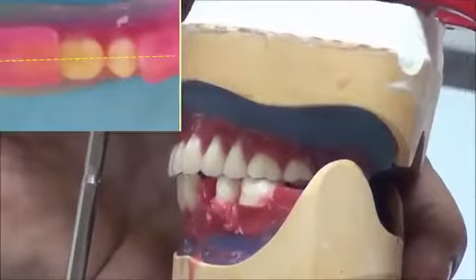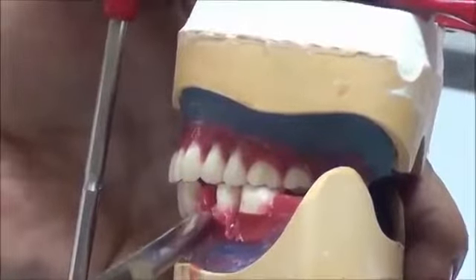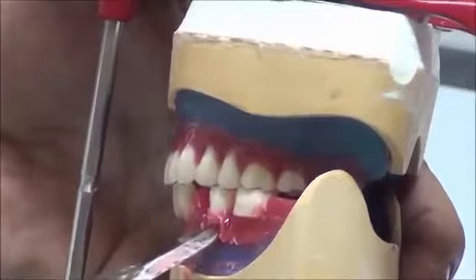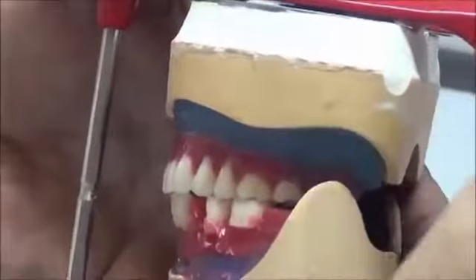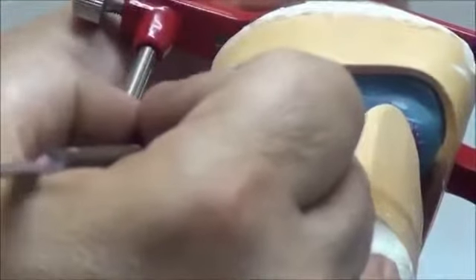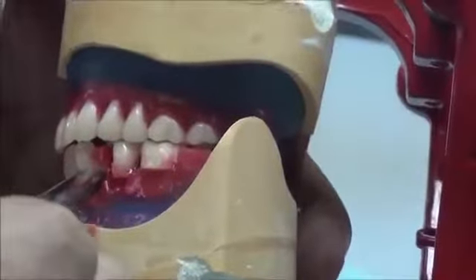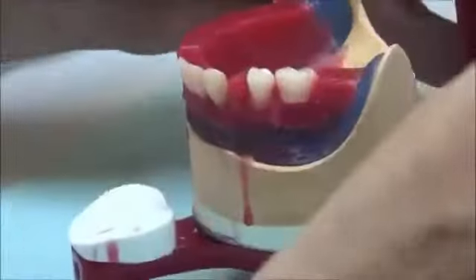Now tooth number 4. In the case that you're setting for patients, the selection of the size of the teeth is important, so you select a size suitable for the patient. The tooth that could have a problem while setting is tooth number 4. After adding tooth number 6 and 5 from the back and the canine from the front, sometimes we don't have space for tooth number 4, so it's the most common tooth that we trim to make it a bit narrower.